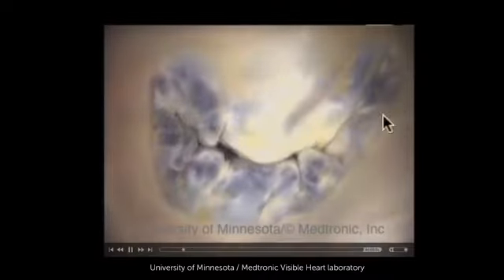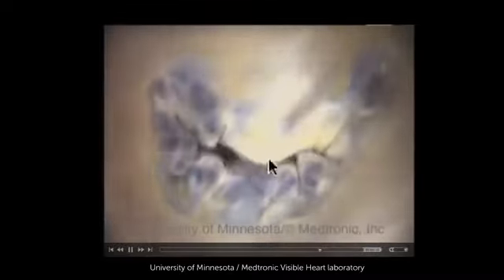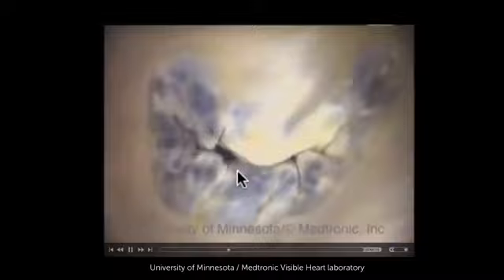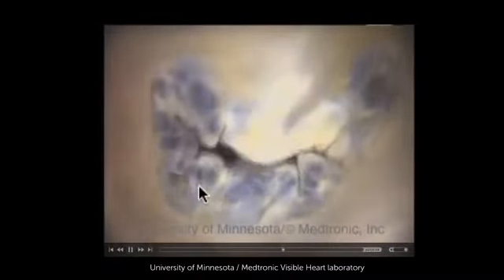Also note that the way the mitral valve closes is not that the leaflets simply touch, but that there is an area. You see how the mitral valve is bent inwards? And so the mitral valve closes along this surface. In addition, note that the mitral valve, especially the posterior leaflet, has small little cusps. We call them scallops.